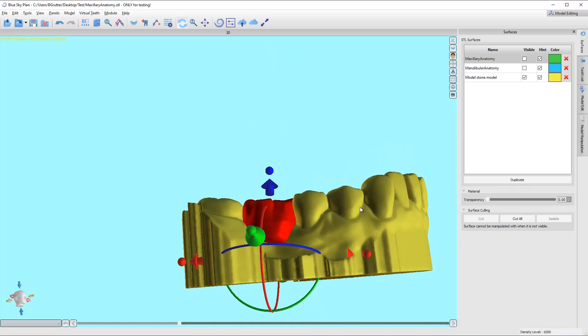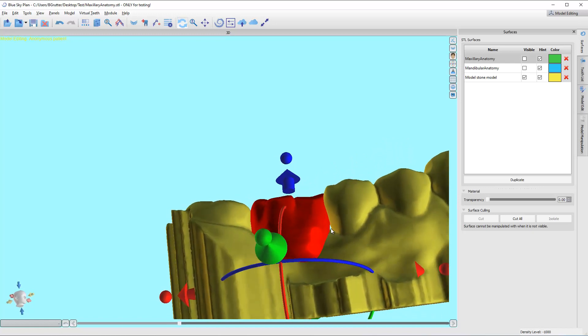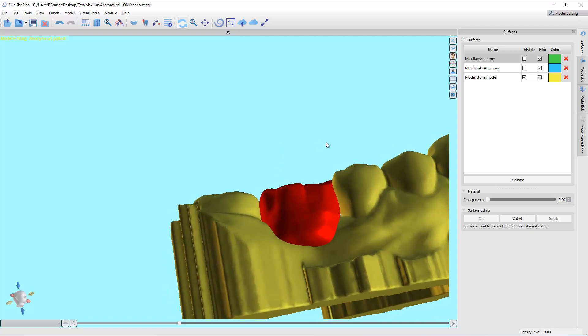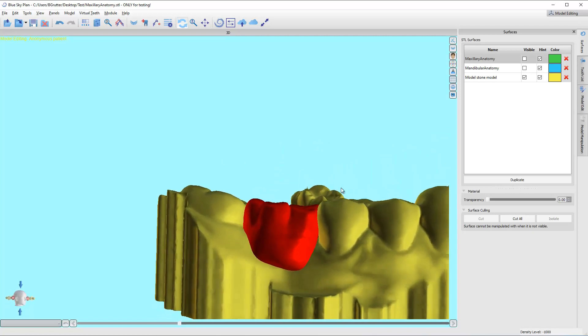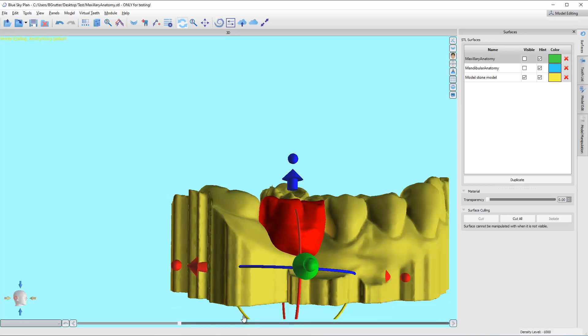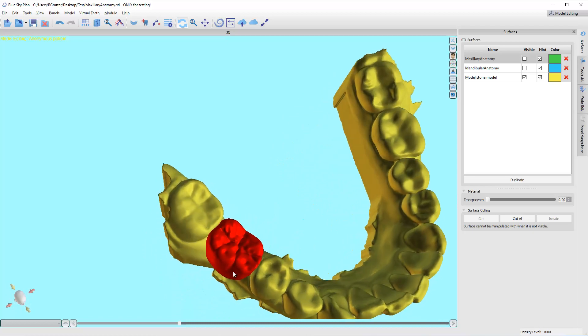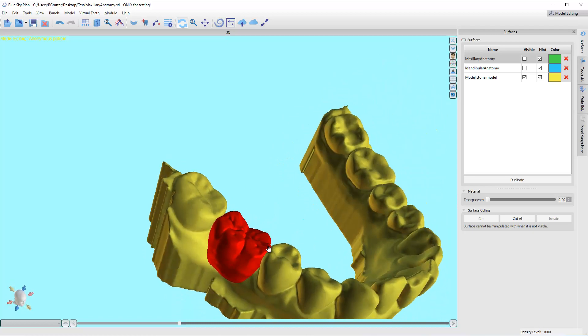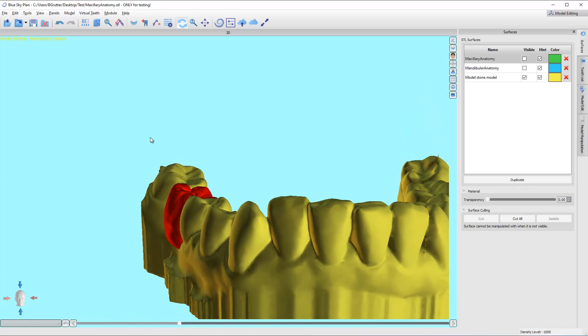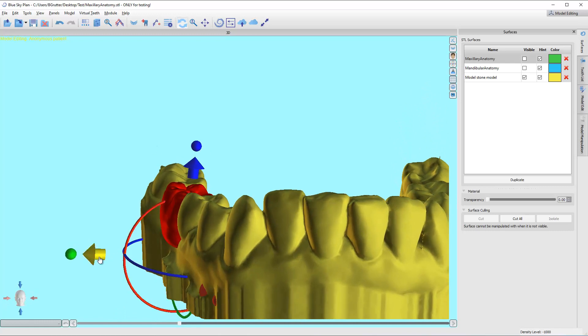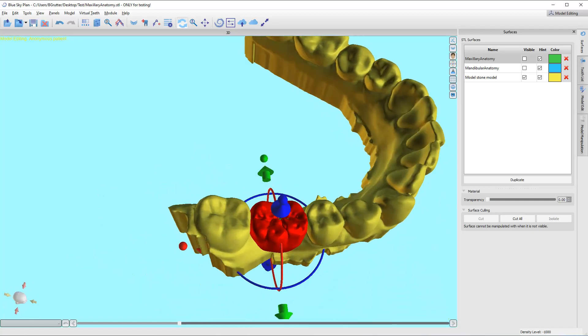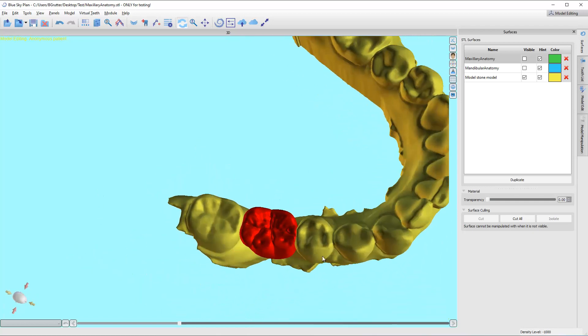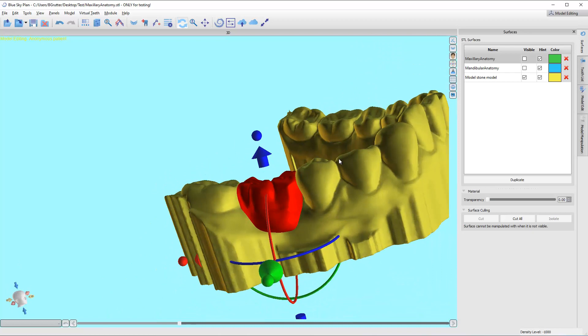It doesn't have to be perfect here, but we're going to spend a little bit of time just getting it roughly in the right spot. We can use these little spheres to scale it wider or narrower. When you have a missing tooth, it's very easy to be left with a little open embrasure spaces. So you can do that by kind of scaling the tooth.